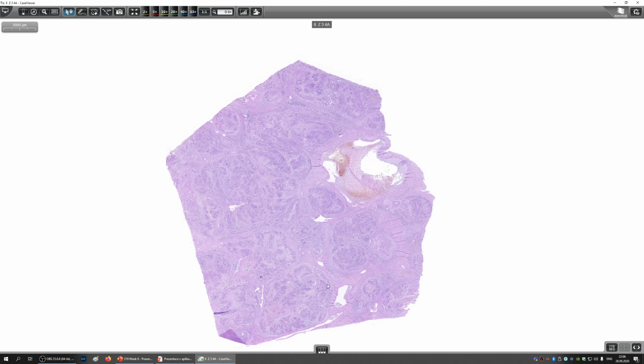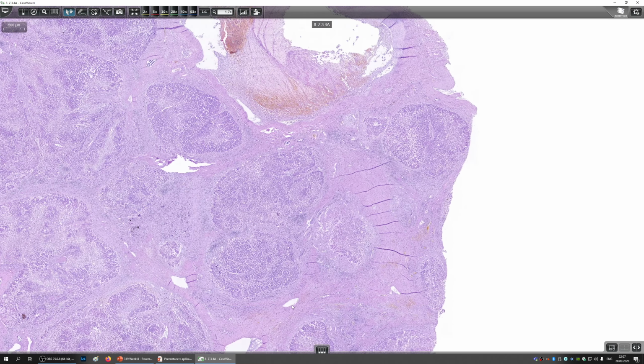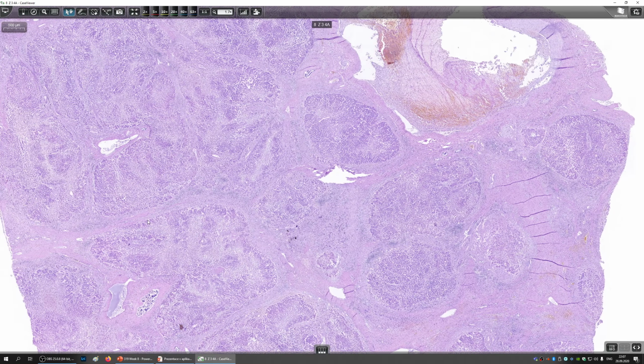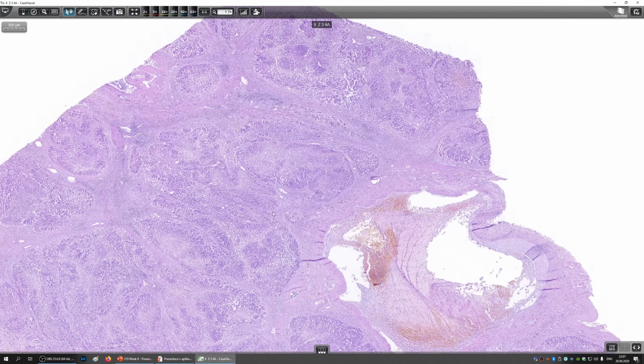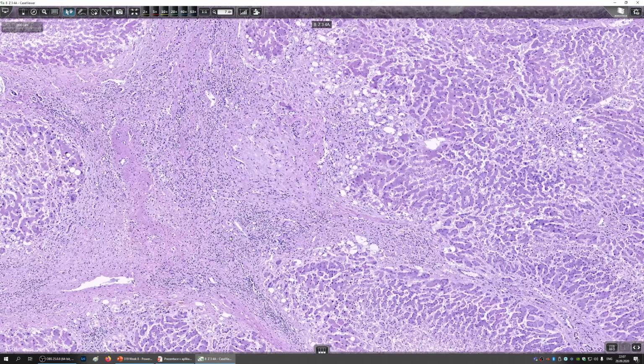So we start by low magnification. You can see the nodules. There are multiple nodules surrounded by a lot of collagen tissue. So these are the cirrhotic nodules. The hepatocytes are forming the nodules and they are surrounded by complete bridges of newly formed collagen. This gives the nodular appearance to the cirrhosis.